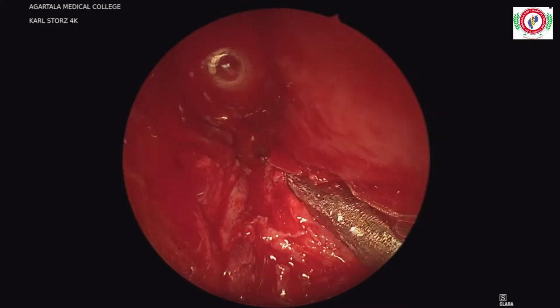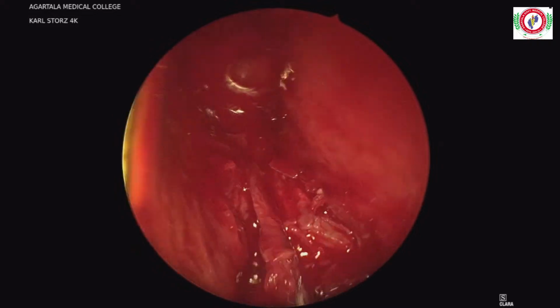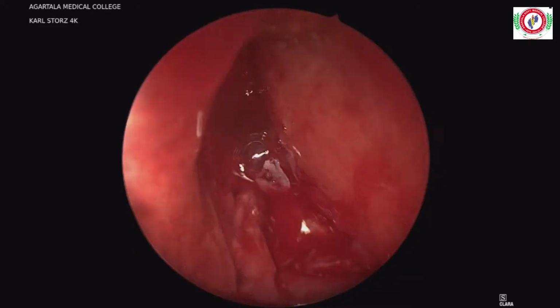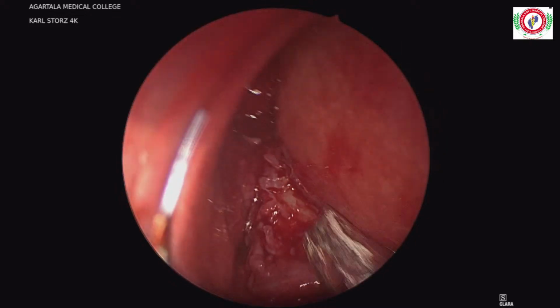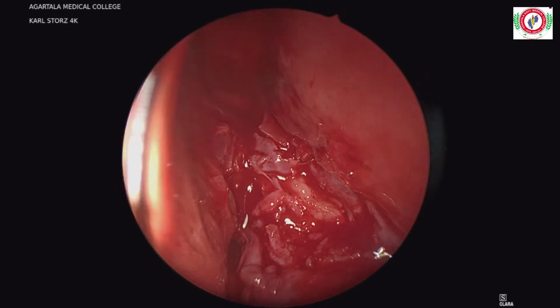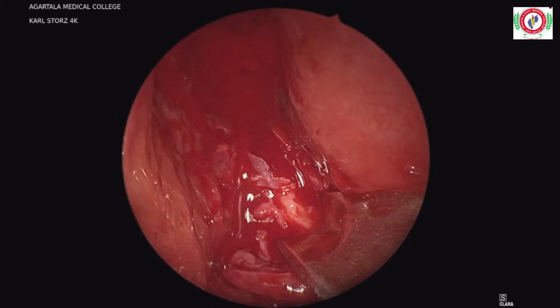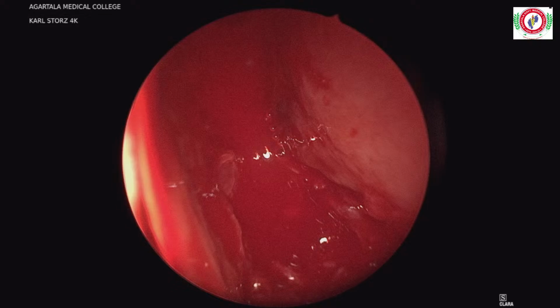Do suction also. So if you find a clear spotter, here you can use a bipolar cautery. All right, so you can use a lot of irrigation and then your suction elevator to keep your field clear. That's all. Chisel hammer now, right? I need to remove this spur.